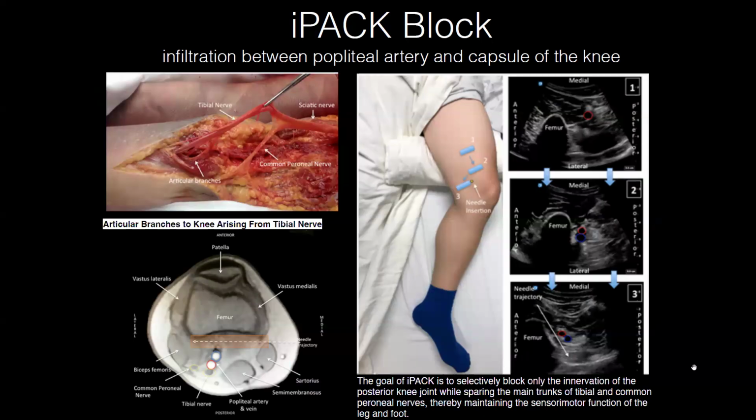Right, again, there's popliteal plexus, needle trajectory. This is the frog leg in the different views, diaphysis, more metaphysis. I get confused with this view. I struggle with it. I'd rather do it lateral.